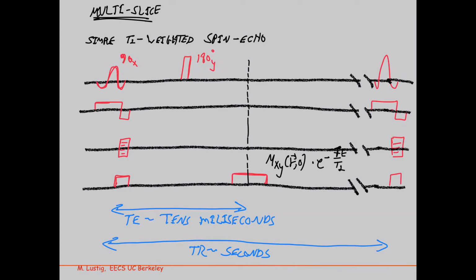If you do a 90X and a 180Y, then those errors don't accumulate as much. So that's one advantage. Definitely, if you keep on doing extra 180s, then those errors will accumulate more and more, and that could be a problem. And so this is why often the 180 is orthogonal to the 90 in terms of the axis of rotation. I'm not going to talk about it too much here, but just FYI.